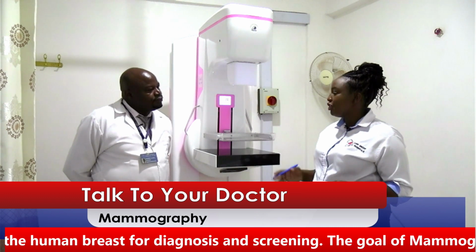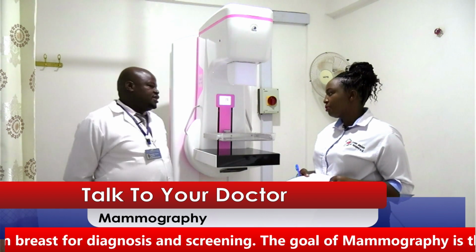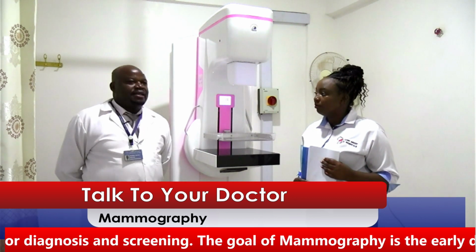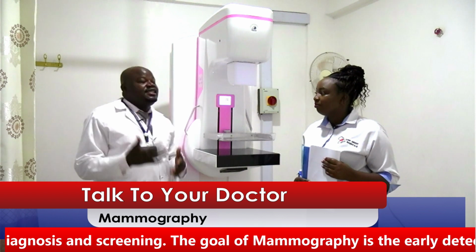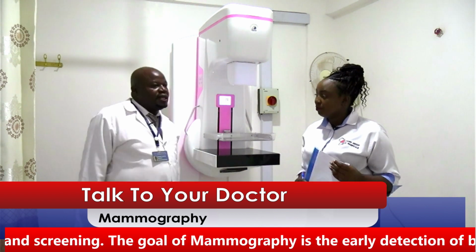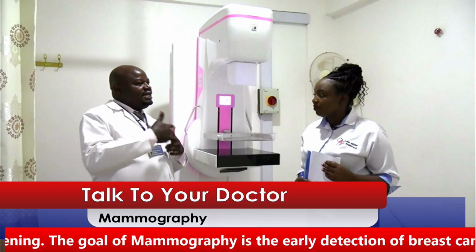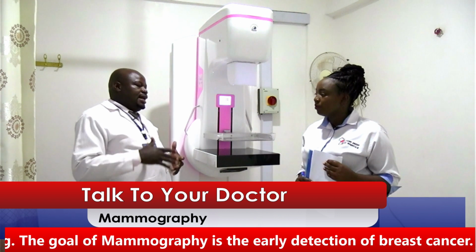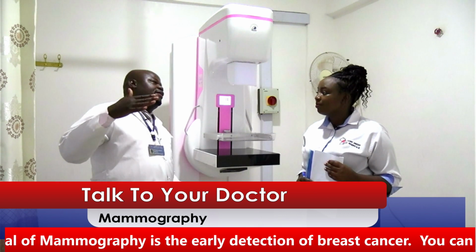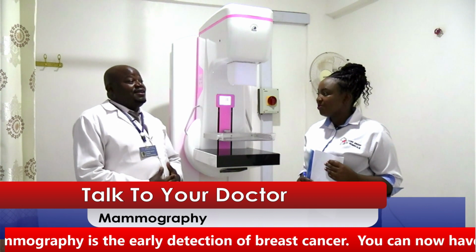Okay, I see the mammogram machine is very important, especially for, you've not told us the age who are supposed to be checked by the mammogram, because I understand it's not all ages who are supposed to be checked. Yes, it is important to note that mammogram uses a low dose ionizing radiation. And you know radiation is not good. But now we have to look at the advantages and disadvantages of using the machine for diagnosis. So the age bracket for the mammogram is from 35 to 39, where you can do a mammogram if there is any presentation of symptoms. But the age that is recommended for screening purposes, you can start screening from age 40 and above. Because of course you have to avoid ionizing radiation when you are below that age, because it's a very tender age of reproduction.